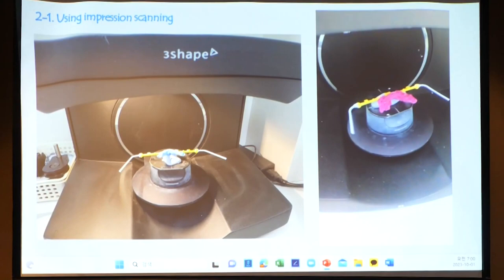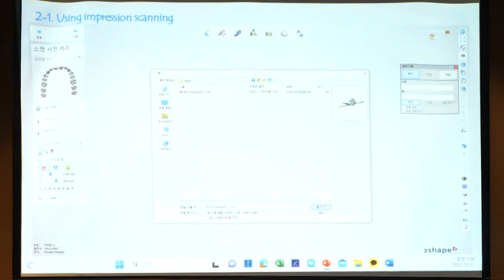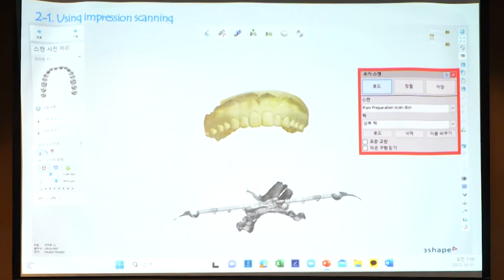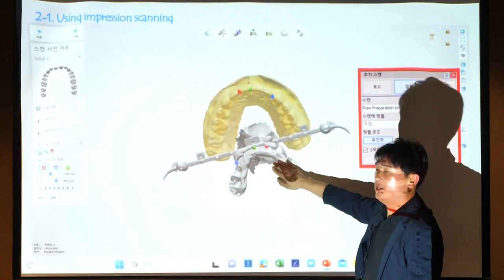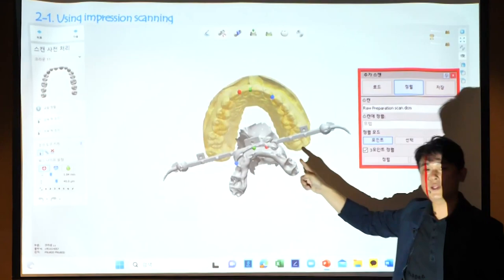And then open this bite in the software, this upper model scan file, and then open the Popo system bite file, and then match together. To attach the upper model and the bite, you have to scan the anterior teeth so you can match the same position to the model and then bite. Click here like this, and then it attaches automatically.